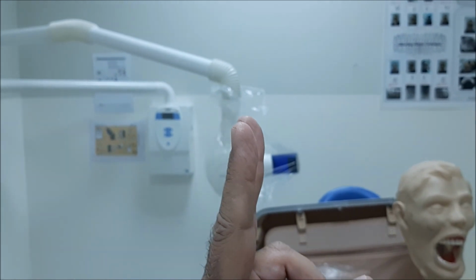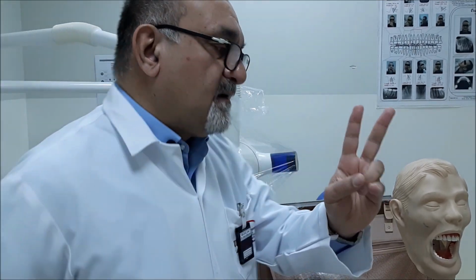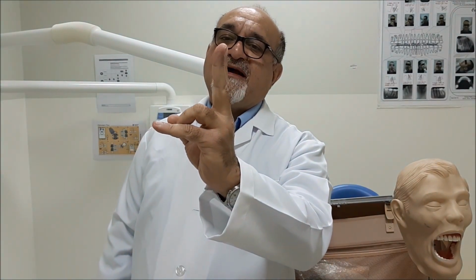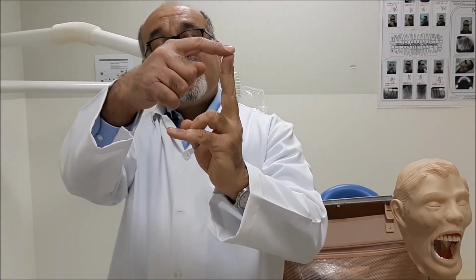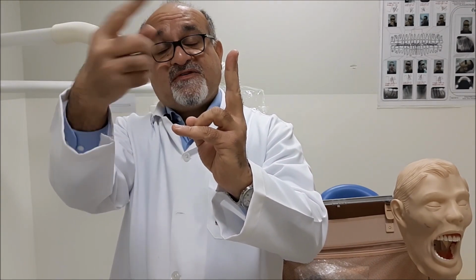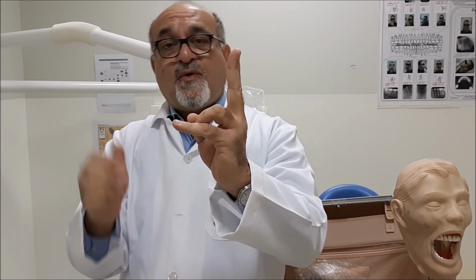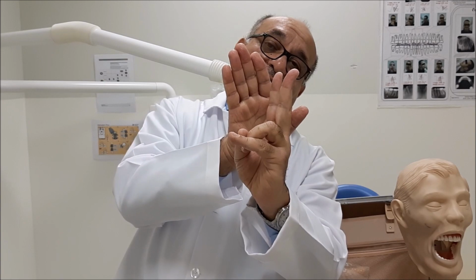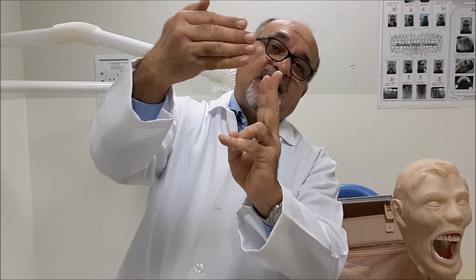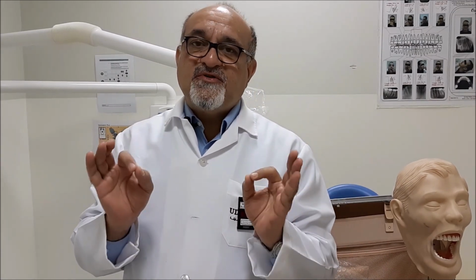Now I want you to try to do it on yourselves. I'll put my index finger covering my middle finger and move my head to the right. You will feel that this one, which is far away from me, will move with my head movement, while if I move to the other side, this one, which is closer to me, will move against my head movement. And this is the principle of the tube shift technique.